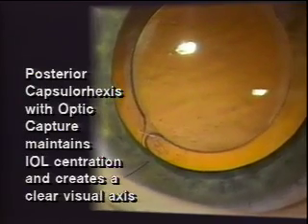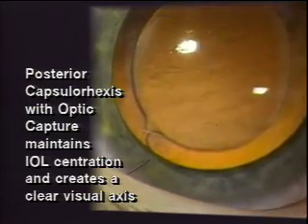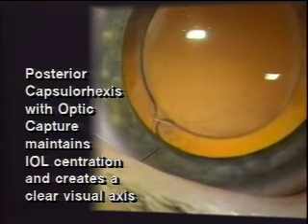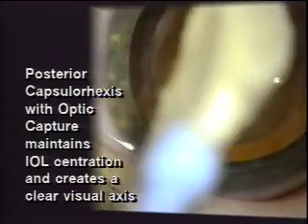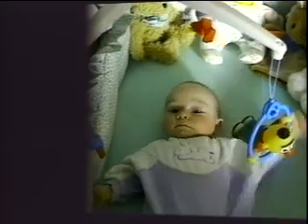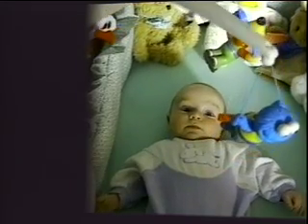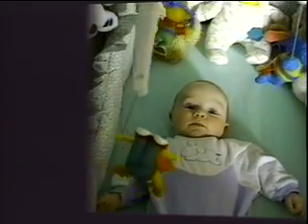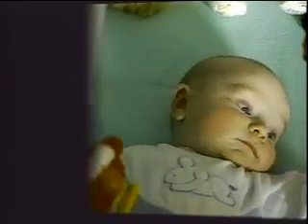This procedure was performed on a four-year-old boy with cataracts secondary to radiation treatment for bilateral retinoblastoma. When performed properly, posterior capsulorhexis with optic capture offers a potential method to maintain a clear visual axis while achieving excellent IOL centration. Also, the need for an anterior vitrectomy may be avoided. Pediatric cataract surgery is technically challenging, but with advances in technology and new surgical techniques, many surgeons are realizing the benefits of the posterior capsulorhexis. Combined with an optic capture, this technique may prove to be a clear solution to many of the problems faced in earlier pediatric cataract surgery.